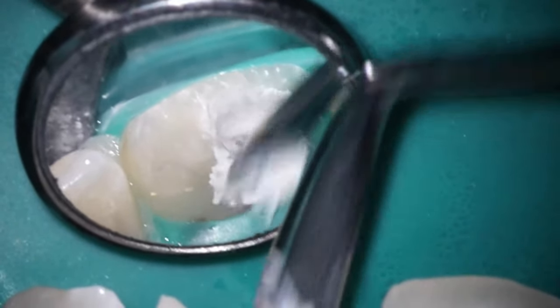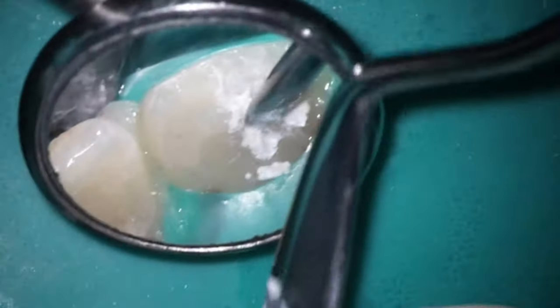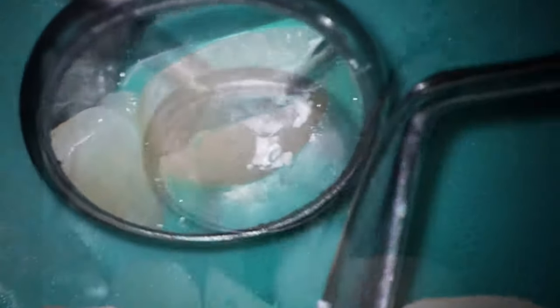Now the one problem with BC putty is it does take about 15 to 30 minutes to set up. So I'm not gonna leave it. This kiddo was ready to go at this point. We're about 3 minutes into the appointment. He was ready to get out of here as soon as possible. So you need to cover it.